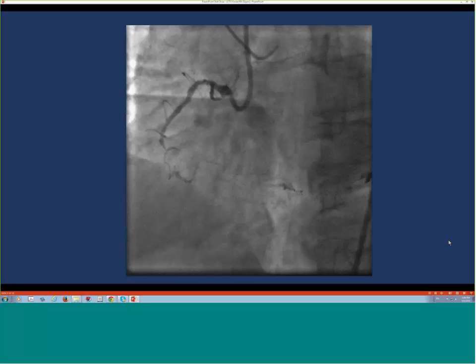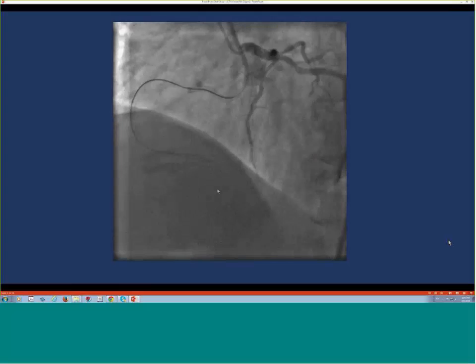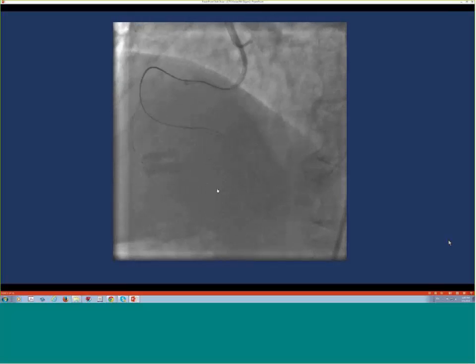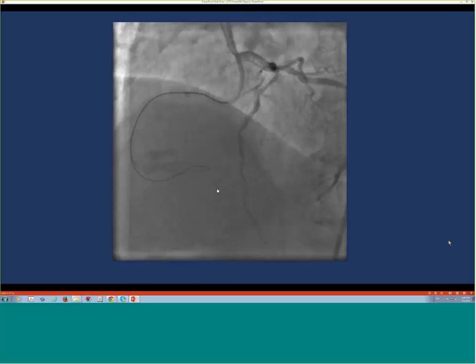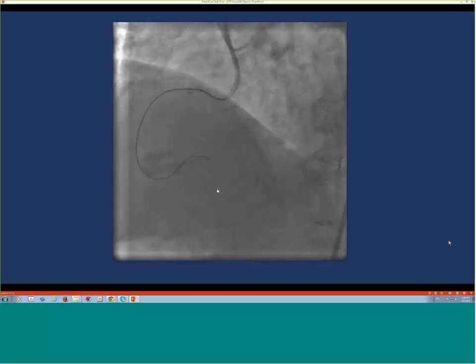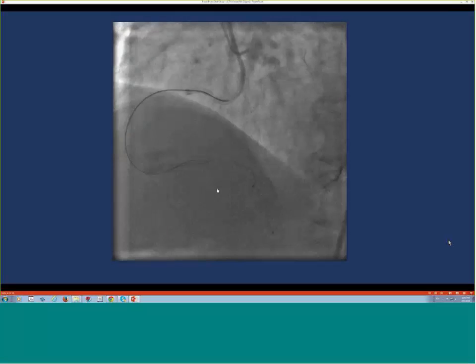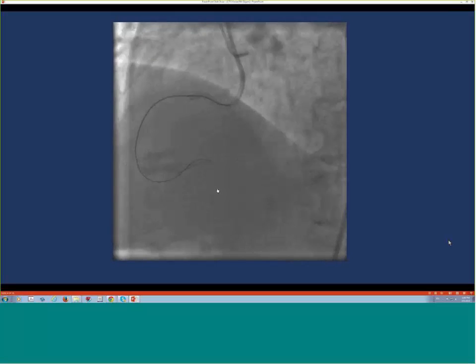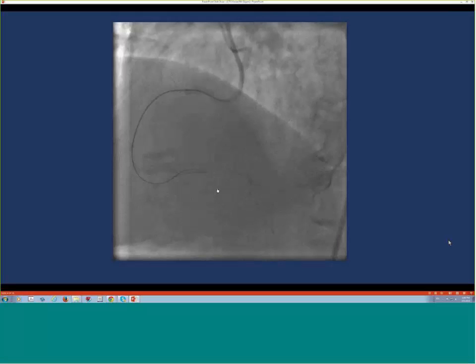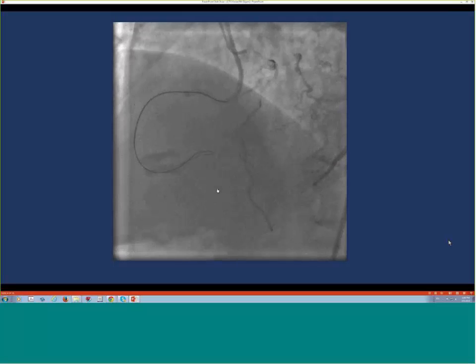And the other microcatheter that I learned about at the CTO Summit last week was this one from Vascular Solutions. And that looked like a good catheter too. Have you had any experience with that? We don't have it yet. They got the Turnpike. So it looks pretty good. Yeah, I think they used it in actually an antegrade case, as you remember, in the summit. It looks fairly good and supportive. I mean, I haven't used it, but I think it's a good thing to have. As you know, there are cases of going retrograde with the wire where the Corsair will not track. Having more options, having the Corsair and also the Turnpike, could be something useful, I think.